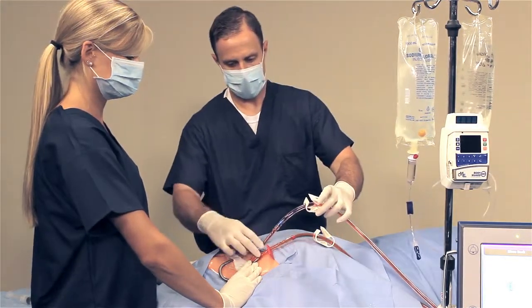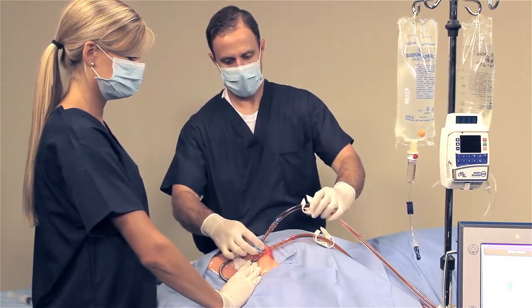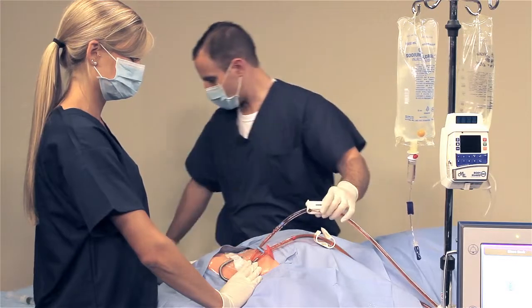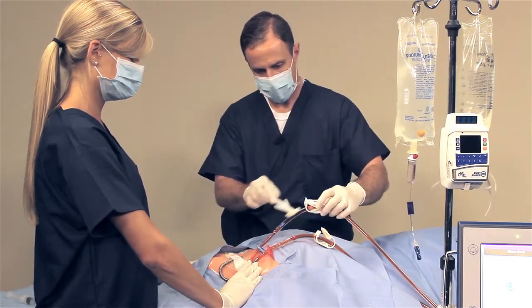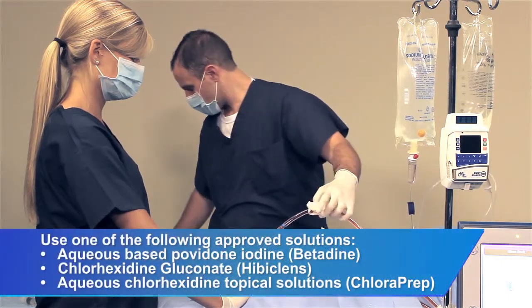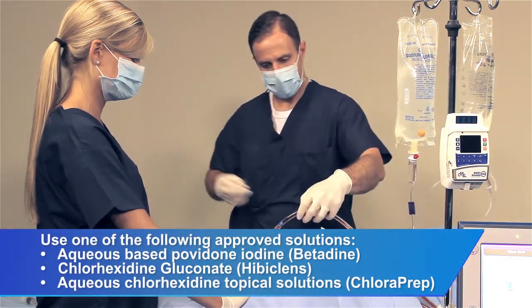Clamp the blue lumen on the catheter. Clamp the blue tube approximately 20 cm from the catheter connection. Next, clean and disinfect a 30 cm length of the blue blood tubing, starting at the catheter barb connector and moving towards the cartridge.